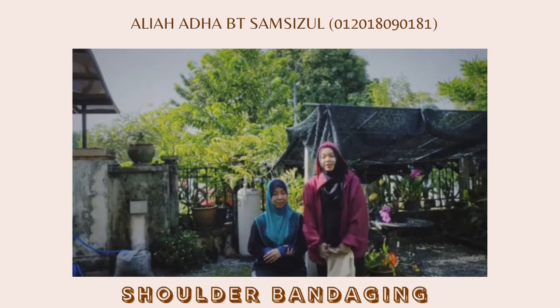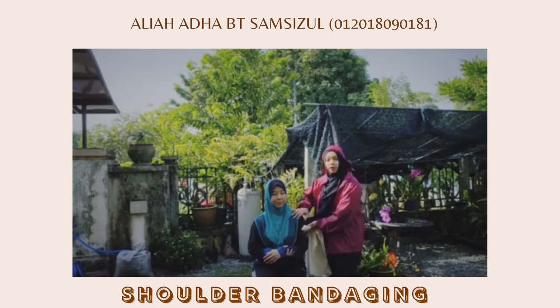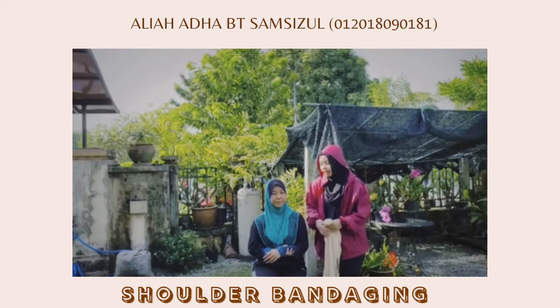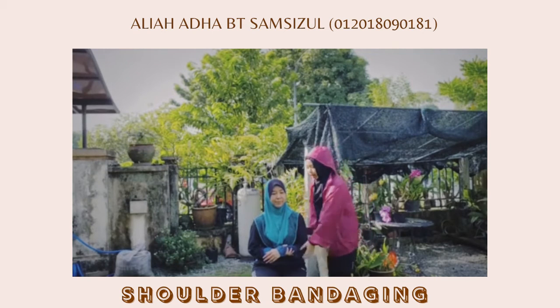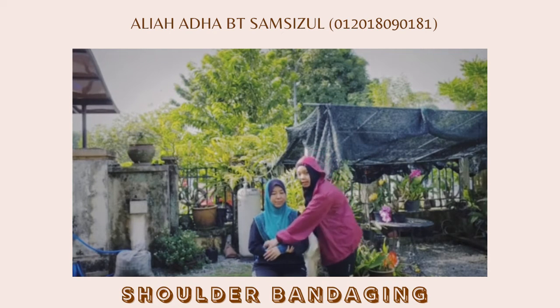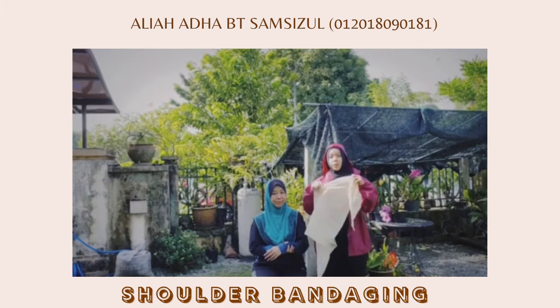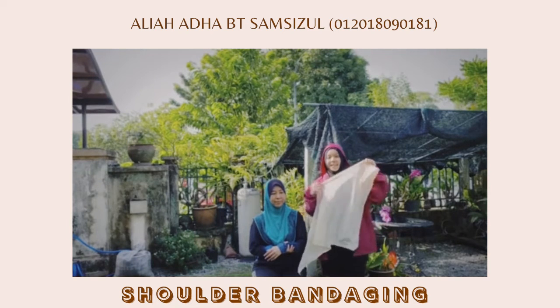And good morning everyone. So this is my first technique for arm sling bandaging using the part of my victim's shoulder. And this is my victim, and the injured arm is on the left side, and she's supporting the injured arm using her right hand side. So all you need for the arm sling is one triangular bandage.